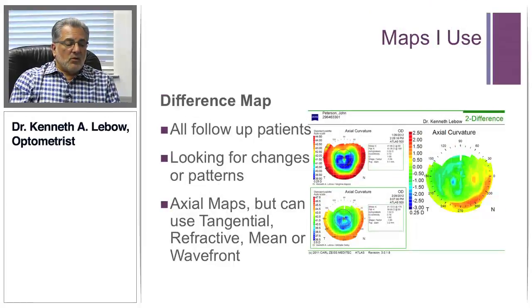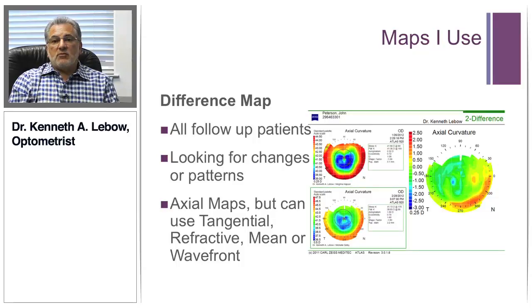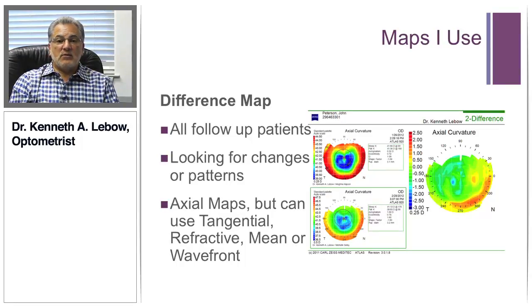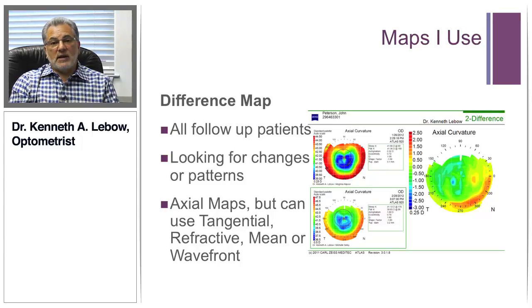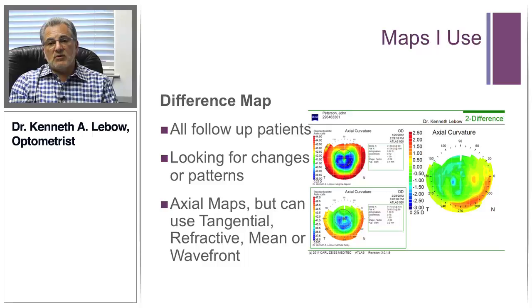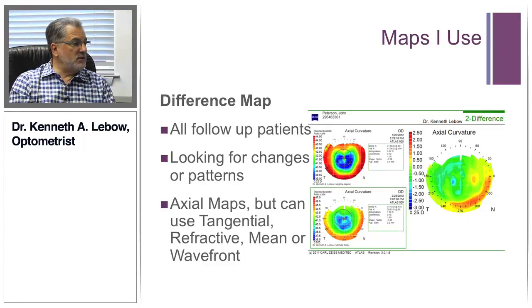So we've already looked at the right-left compare map, which is very valuable. Another map I like to use a great deal is the overview map, demonstrated with the previous patient. A third map I like to use is the difference map, because it gives us the opportunity to monitor change over time — and that's really what we want when we deal with ongoing patients.